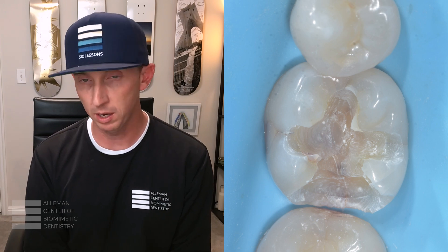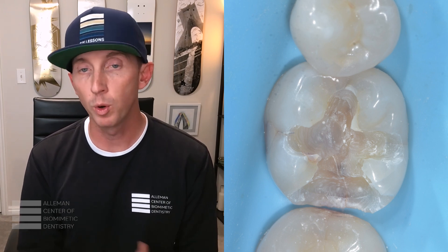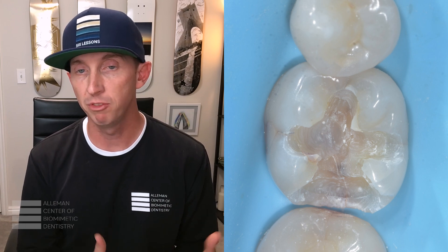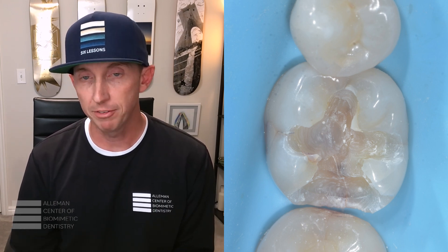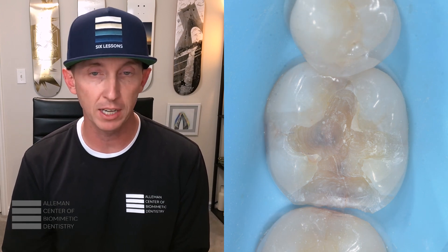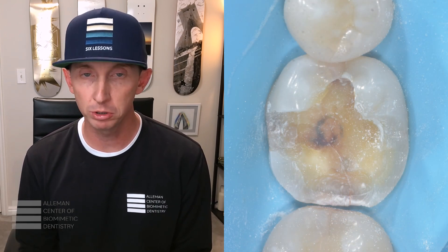Here I've started with depth cuts, as I'm going to do an indirect restoration to help visualize the fractures that I'm treating. After I've onlayed the distal portion of the tooth, I can see that the fracture is running in a vertical nature.